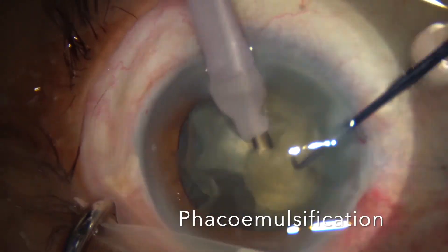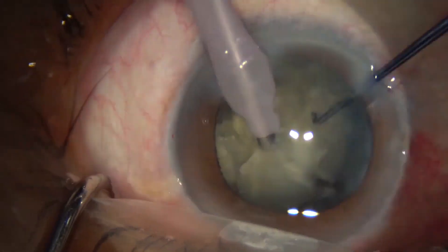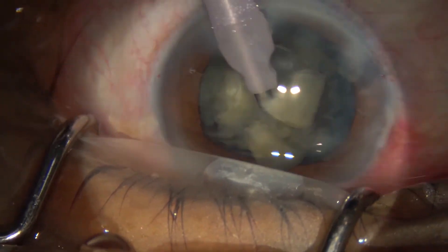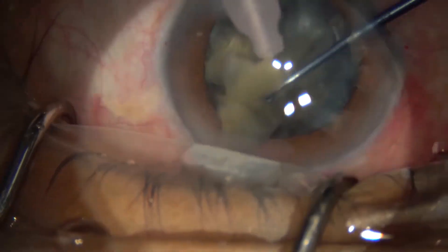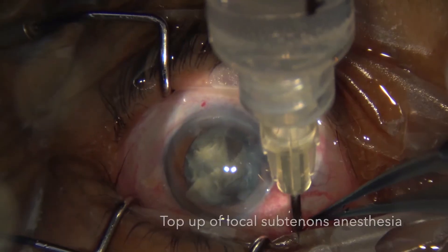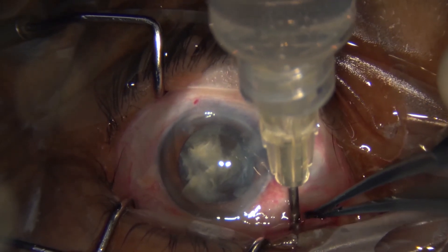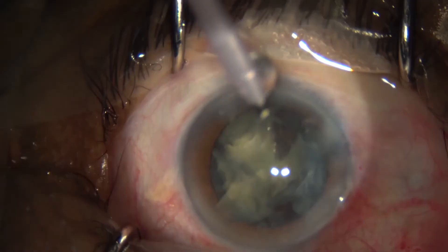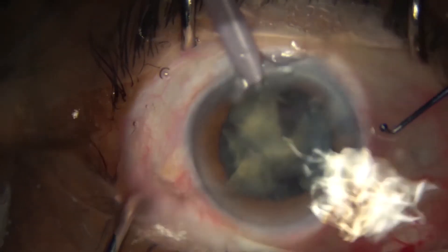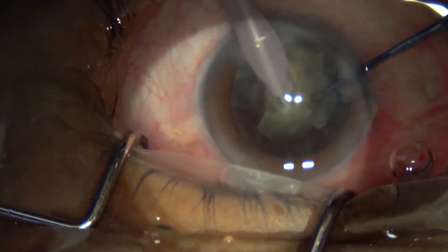In between steps, we top up the viscoelastic to protect the endothelium. Because the probe kept getting occluded due to the dense cataract, we also had to clear the tip externally by removing the probe and rinsing it with a bottle of BSS. At the halfway mark, the cataract was very adherent to the capsular bag, so we used viscoelastic to push and dissect it away before continuing to phaco-chop.